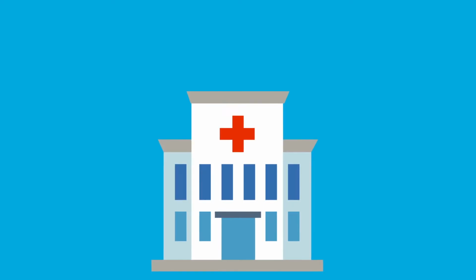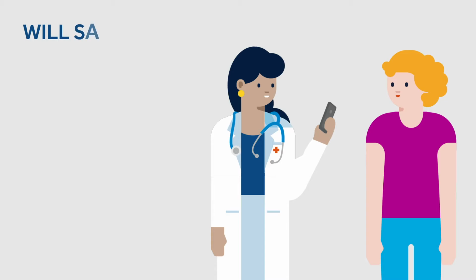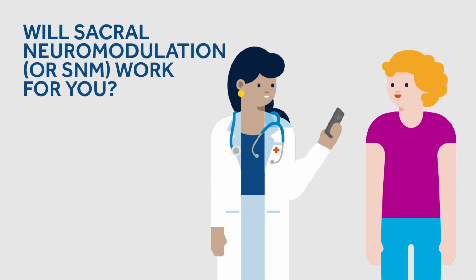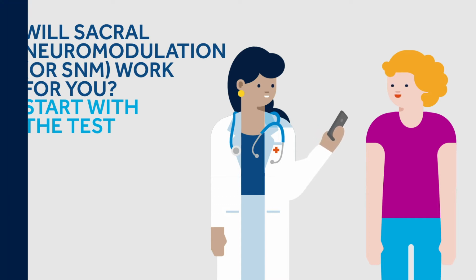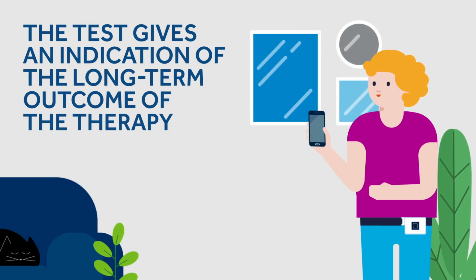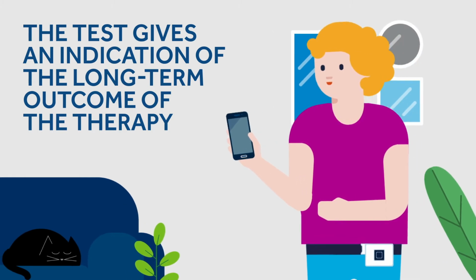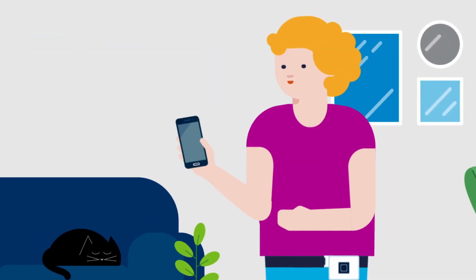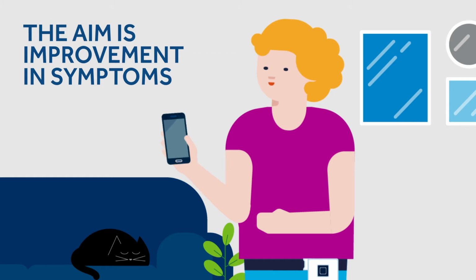The following video will explain to you what it means to start with the evaluation test phase. The evaluation is a temporary phase to see if this therapy works for you and whether your symptoms improve. We are looking for improvement in your symptoms. Depending on your condition, this could be a reduction in accidents, a return to normal toilet habits, improved hold time, less incontinence products used, less medications and/or improvements to your quality of life.